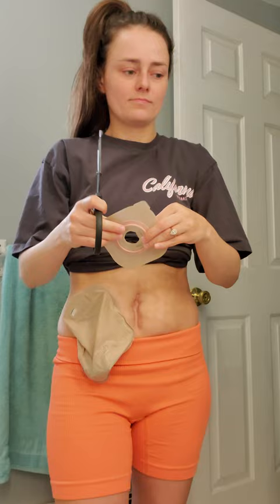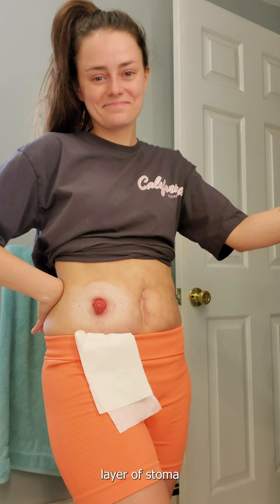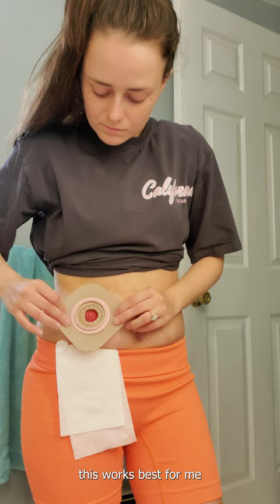If my skin isn't too excoriated or raw, I'll skip the stoma powder, like I did this time. If it's bad, I'll do a very light layer of stoma powder sealed in with skin barrier spray. I find that this has worked best for me and it leads to a long-lasting pouch.